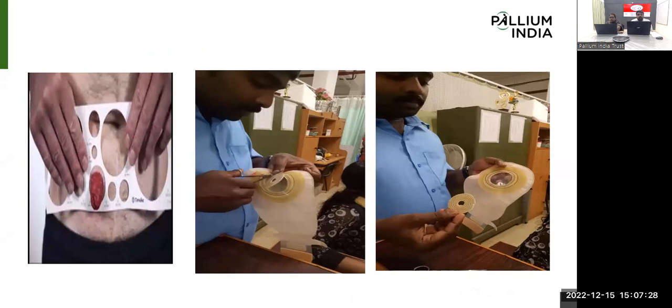Mainly, the first picture shows a measuring gauge. Measuring gauge means one patient's colostomy size will vary. Maybe in one patient the stomal size is very small, in another patient a little bit larger. So according to the size of the stoma for the patient, we will prepare the faceplate. While purchasing the colostomy bag, with that we will get a measuring gauge. The measuring gauge has circle-type holes. For every hole, the size value can be seen near the circle.